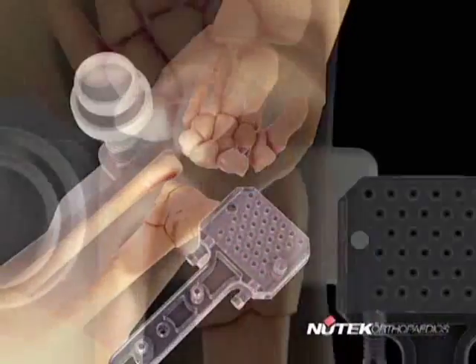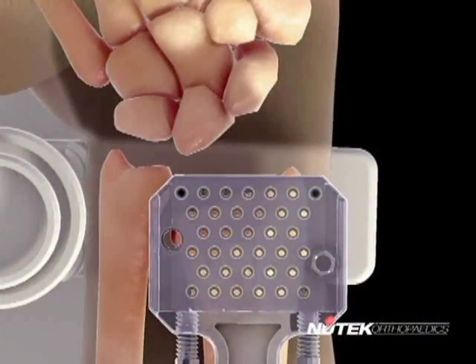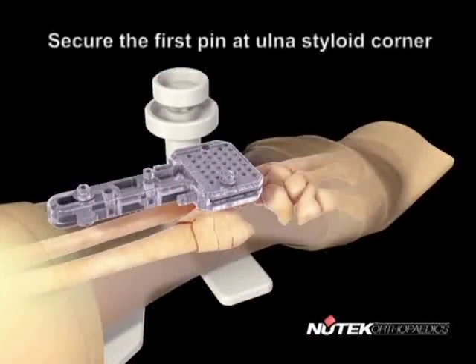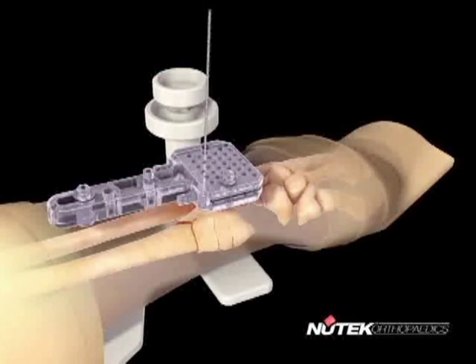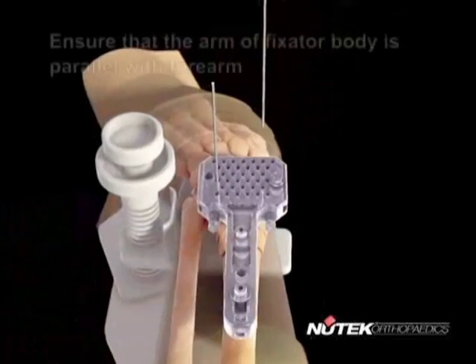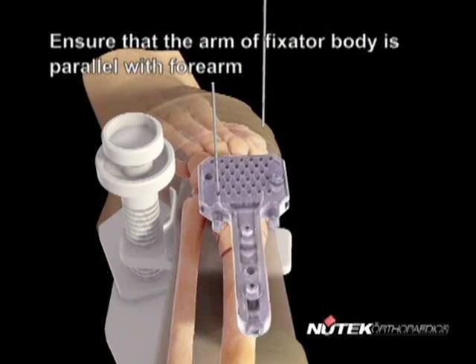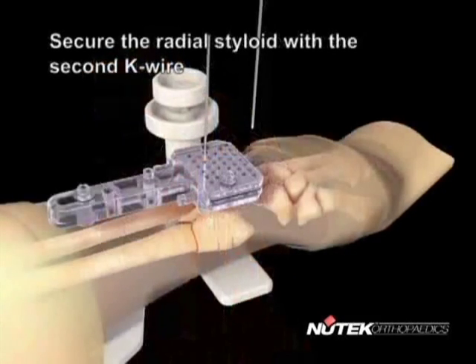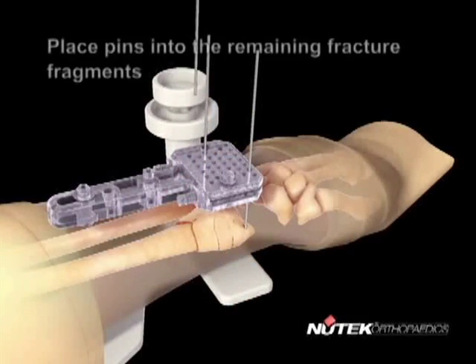Place the NBX fixator body over the fracture over the dorsal aspect of the wrist. Secure the first pin at the ulnar styloid corner. Ensure that the arm of the fixator body is parallel with the forearm. Secure the radial styloid with the second K-wire.